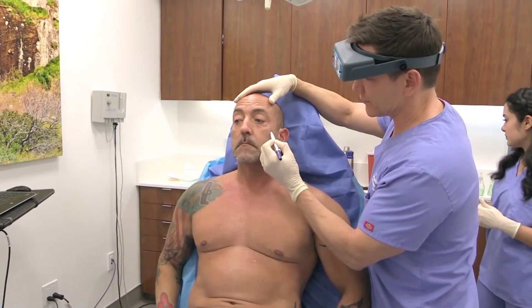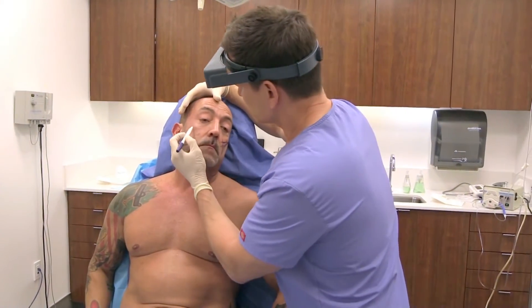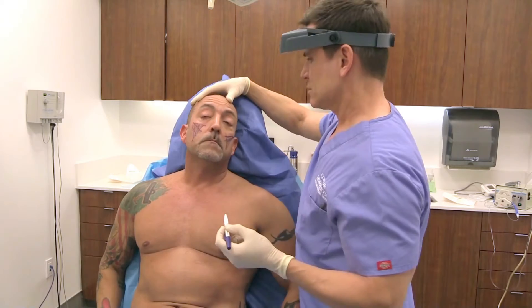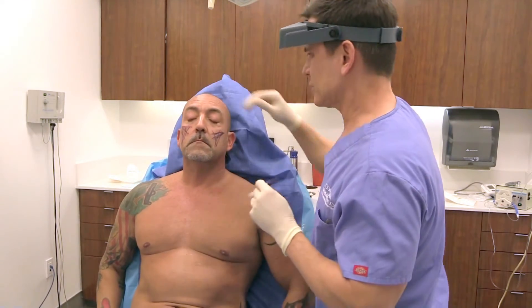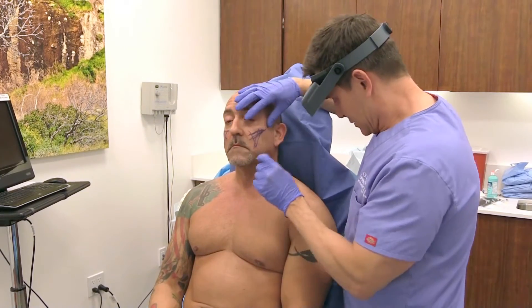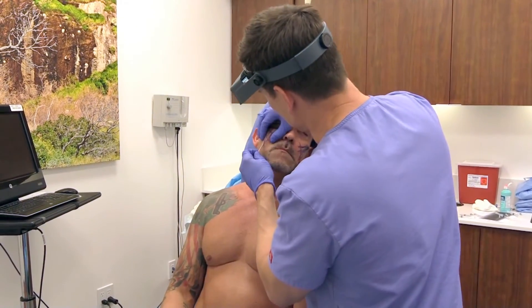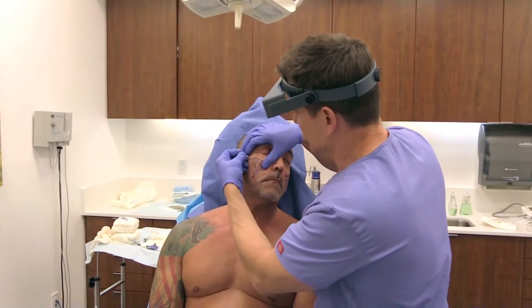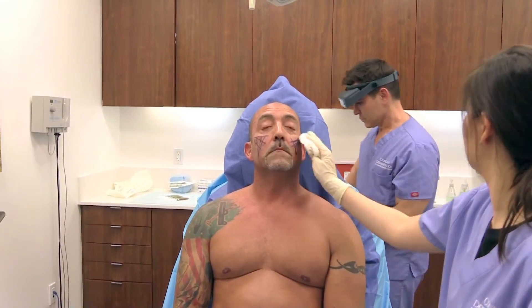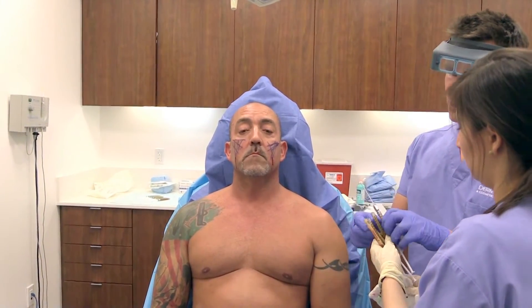You can see the greatest amount of fat right here. Now we're going to do the injections. We make a small puncture — actually two small punctures — for our access points. There'll be a small amount of bleeding. The nice thing is this won't leave any scar and it won't be sore anymore at all. We'll use a blunt tip injector, so this leads to minimal bruising.